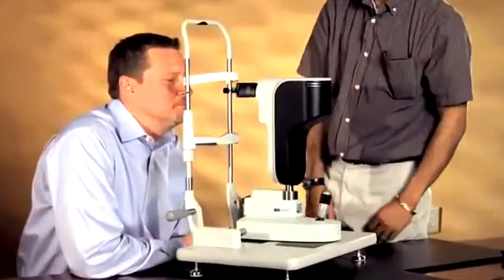Hear what expert Dr. Warren Hill has to say about Lens Star: 'What I like about the Lens Star is that it's very, very flexible. The measurement head and the computer are separate — this is huge. It allows the computer to be a real computer, not just a computer hooked up to a measuring instrument. Every aspect of the measurements can be individually looked at and validated by the user, and if something's not right, the user can actually correct it.'